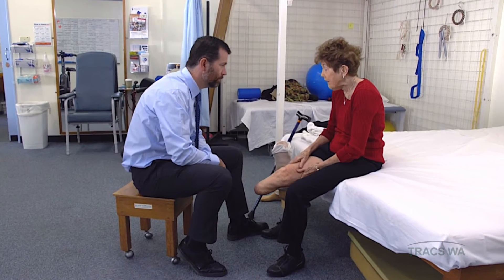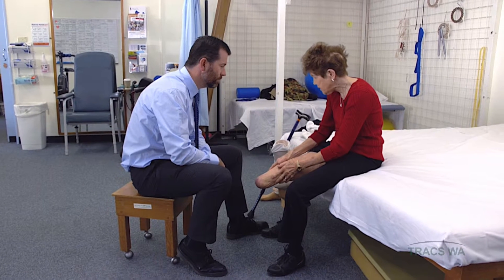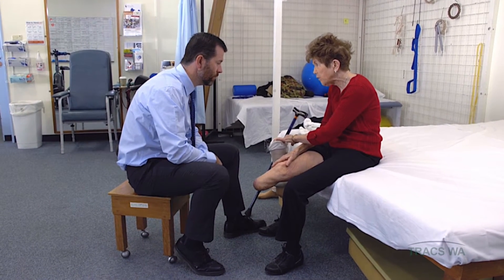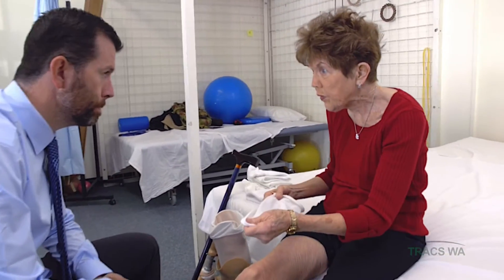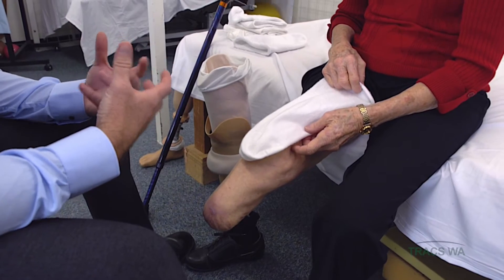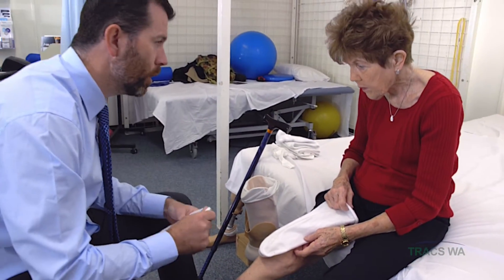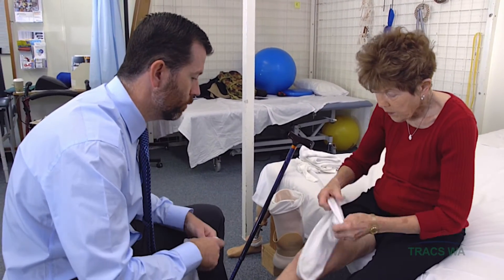How's your prosthesis travelling? I think it's shrinking a lot now and I'm starting to have a lot of movement inside here. How many socks are you wearing? I'm actually just wearing this one, and that, and the nylon. So as we've talked about, we might need to increase the socks. I watched you walk in and it looks quite loose, so we're going to try and add a thick sock. Pop on the thin sock for me.